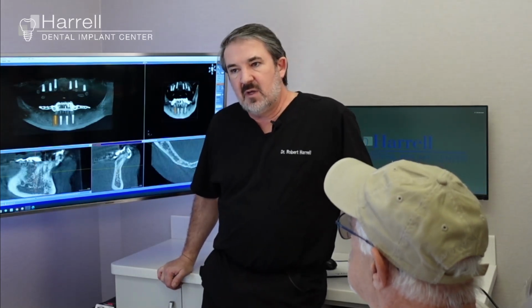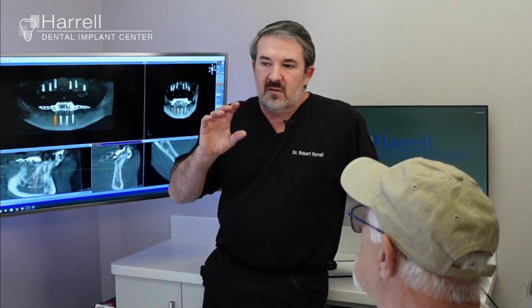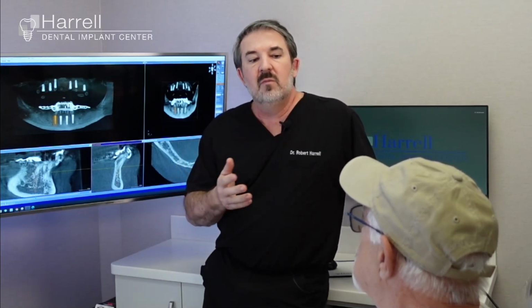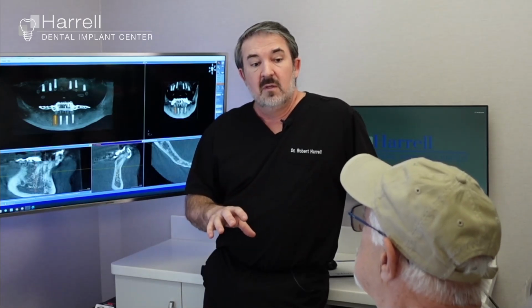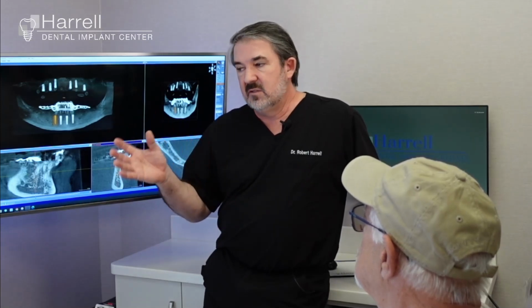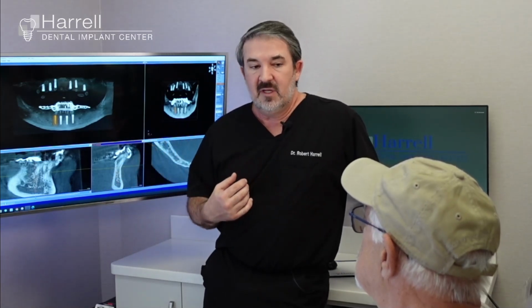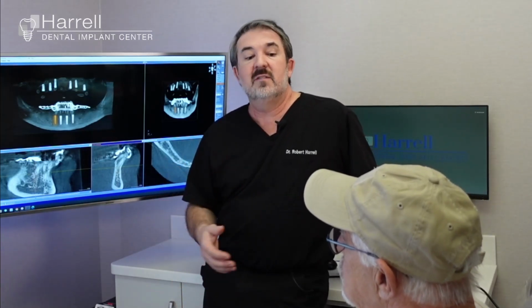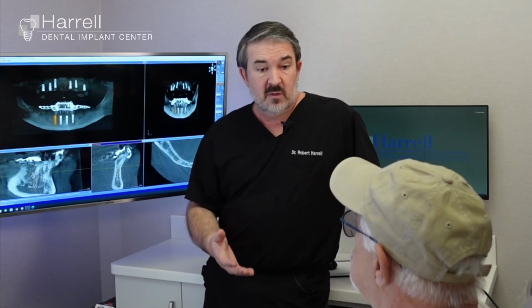So if you came in and said about your temporary set, hey, I'd like to have them a little bit longer, I want to see the teeth look a little bigger, or can you shift them this way or that way? Little small things that make them look like they're a part of you. We record all that. We've got multiple people looking at it: the assistants, my lab guys, I'm taking a look at it, and you're looking at it. So we get all the opinions in for what we feel like we need to see. And the most important one is yours, of course.